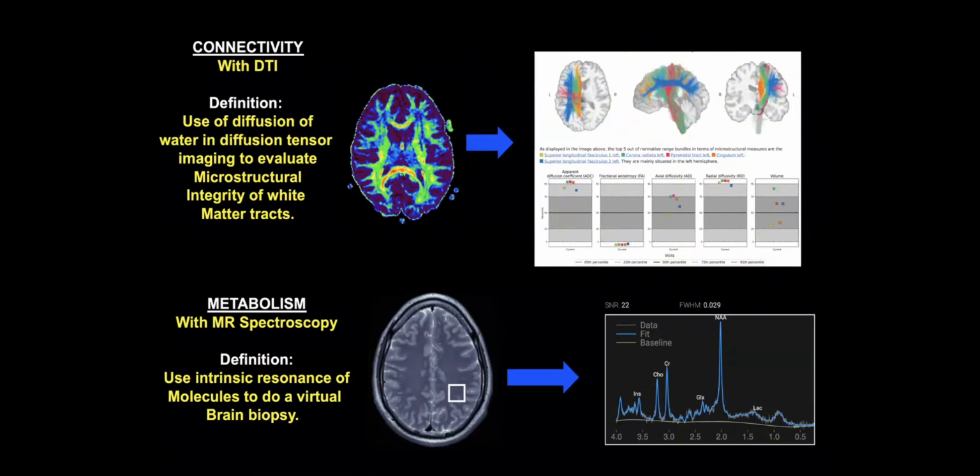We can see that these areas are all below the 5th percentile. That's important because we're able to see that these are important areas that are affected. They include the cingulum, the longitudinal fasciculus, and the corona radiata, really targeting areas that are affected primarily in the frontal and the parietal lobes. And so that's a very important point of assessment that we can use this technology for.